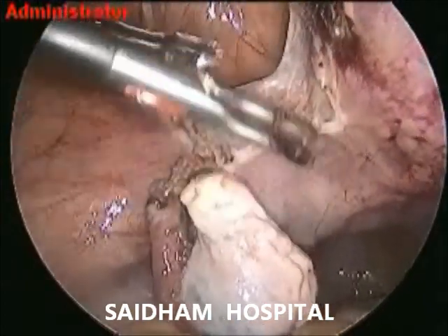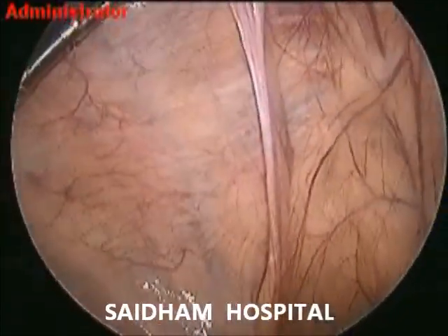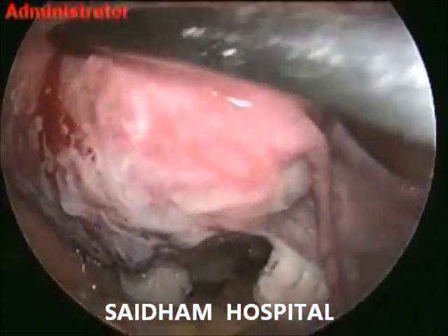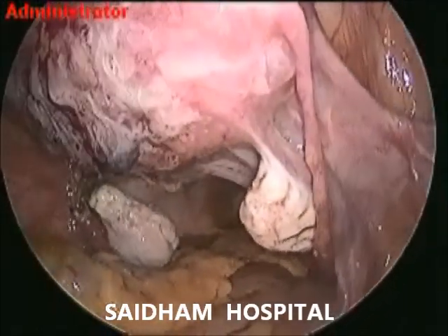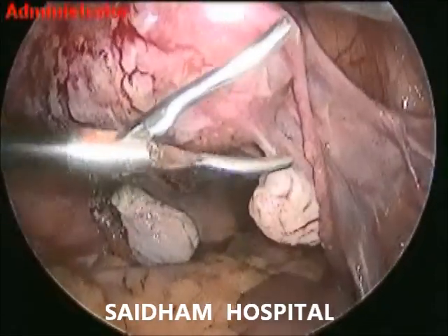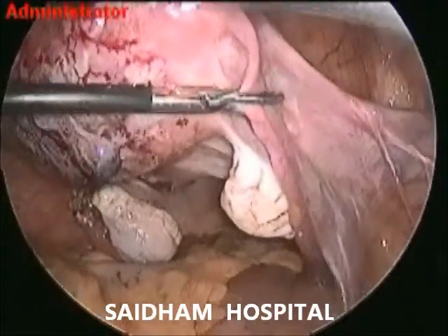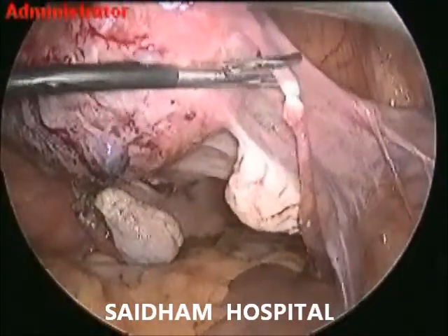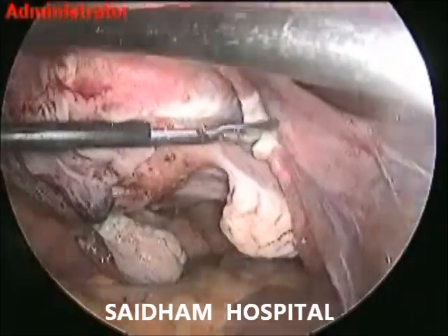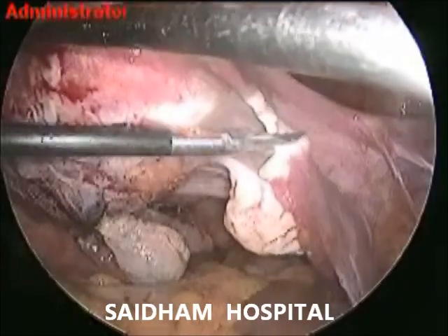This step can be bypassed in previous cesarean scar, big myoma mass, severe endometriosis, severe PID, or severe fibrosis. The POD is stuck up with endometriotic implants and fibrous tissue, causing subfertility, infertility, and chronic pelvic pain. These are the common issues for this patient. That's why repeated surgeries and adhesiolysis may increase operating time, bleeding, and higher chances of infection.